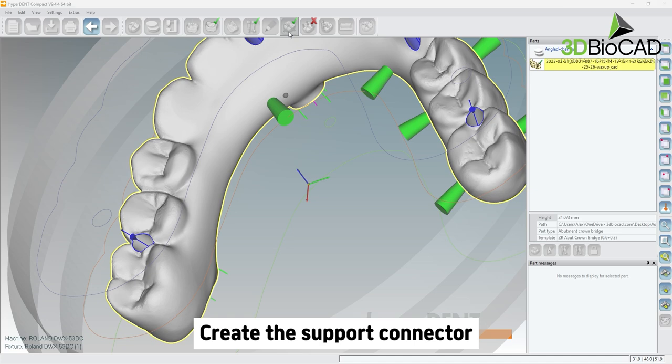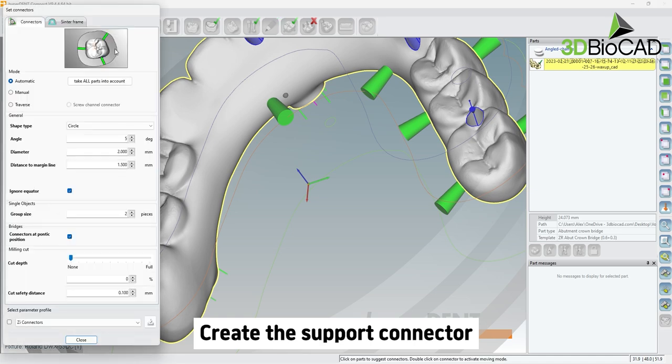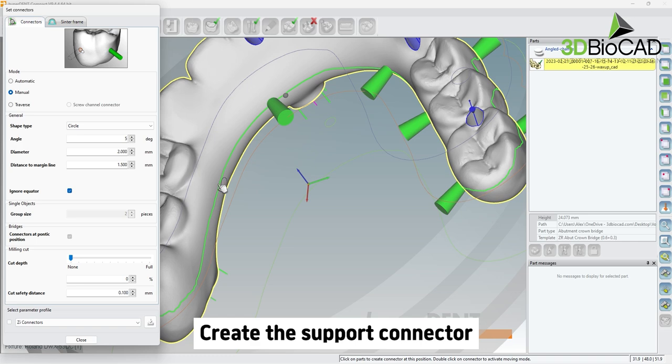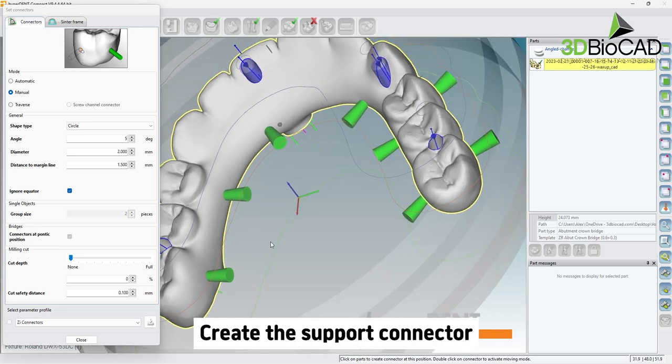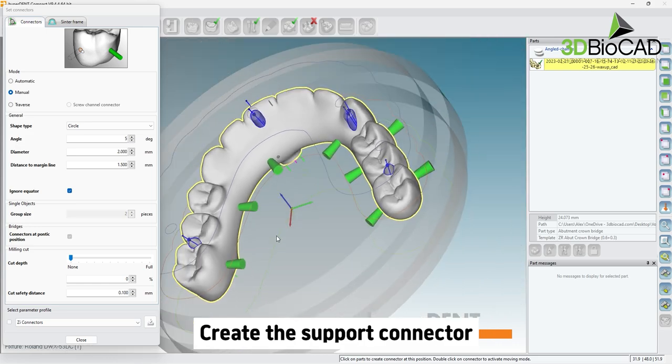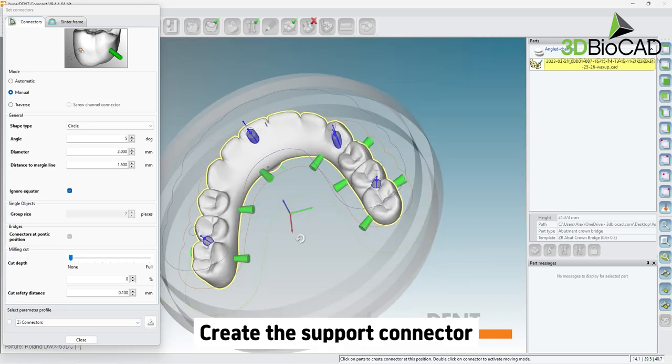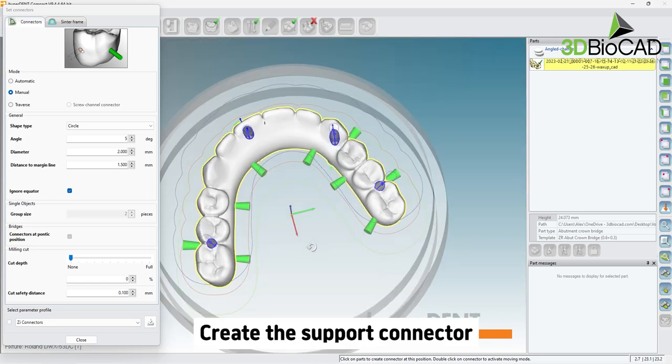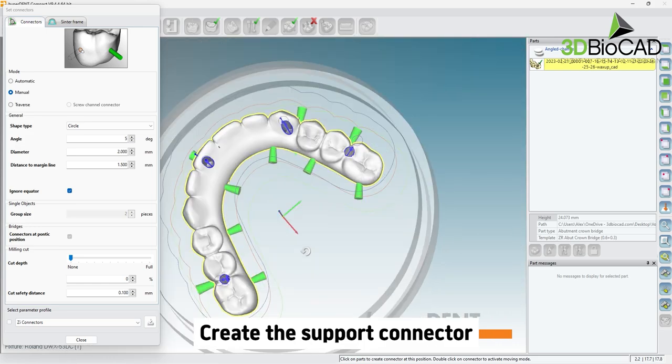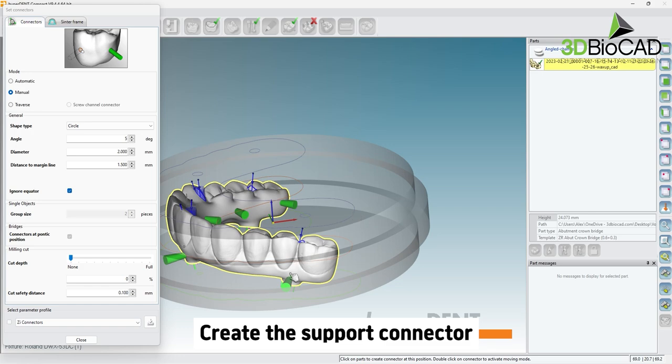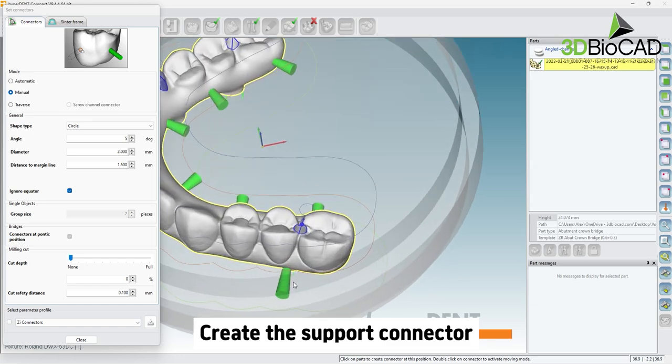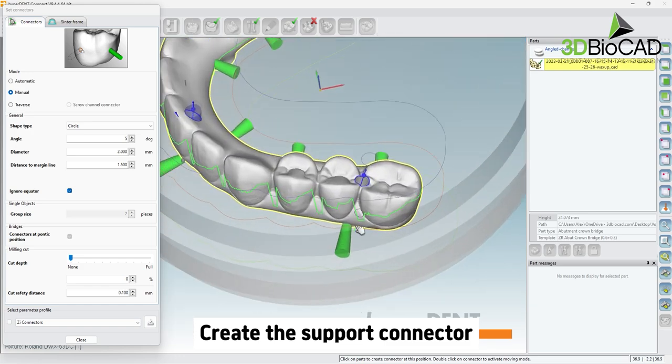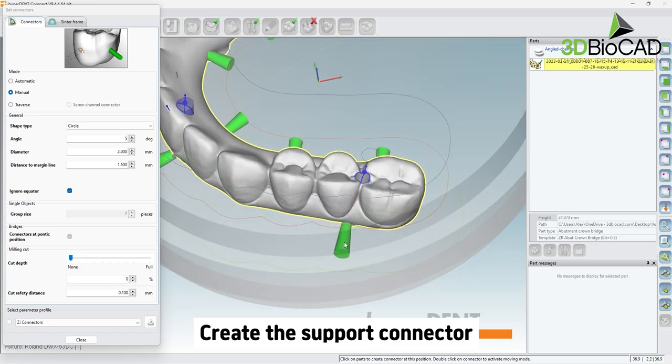You can add or remove connectors as needed by selecting a connector and using the delete button on your keyboard to remove, and choosing the connectors button to add more. Connectors should be spread out and not too close together. Also try to avoid connectors in the anterior facial of the bridge.